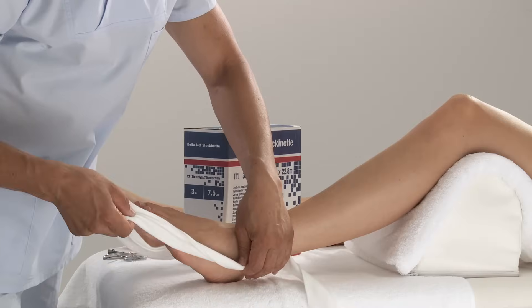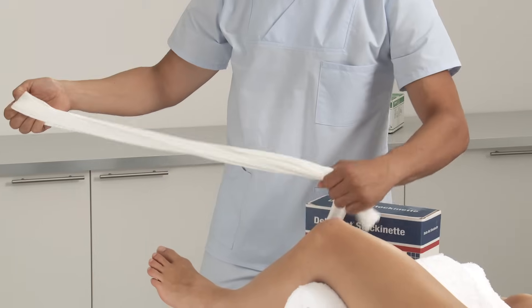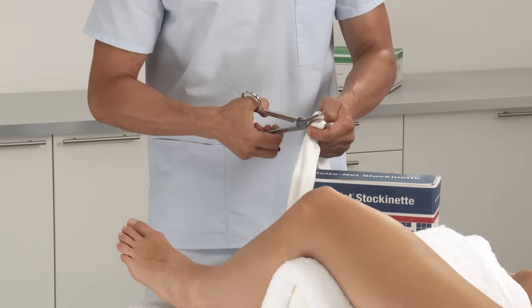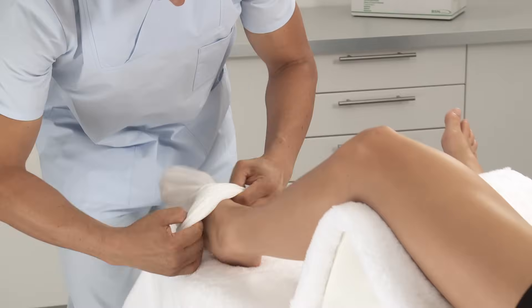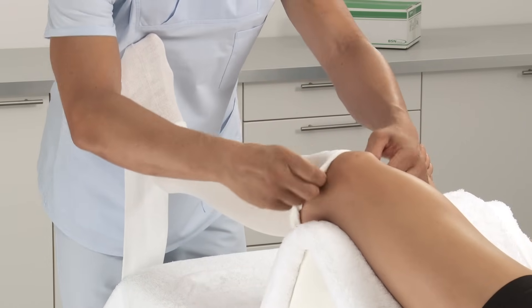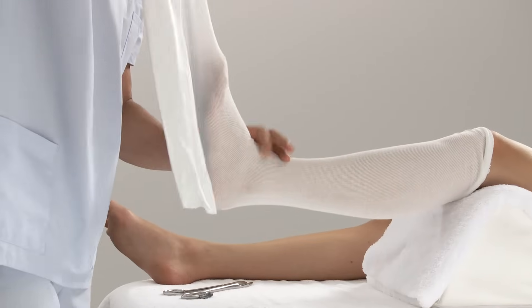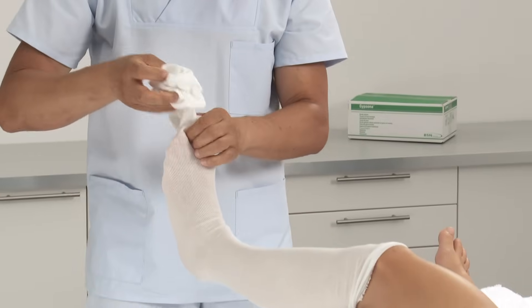Choose the appropriate width of stockinette. Measure the length from knee to toes, double the length and cut. Roll up the stockinette before applying onto the limb to overcome sliding pressure during application. Roll off over the leg and remove all wrinkles and creases.